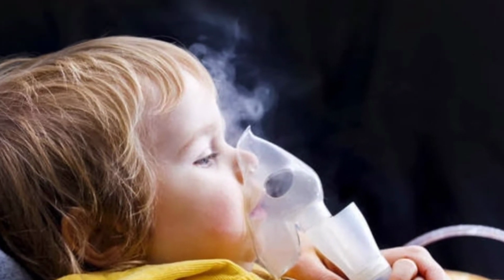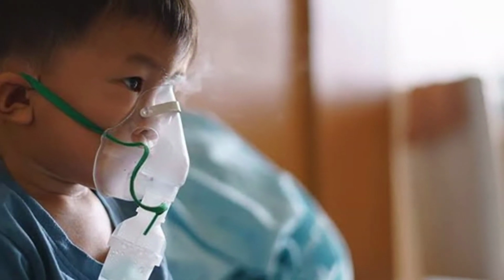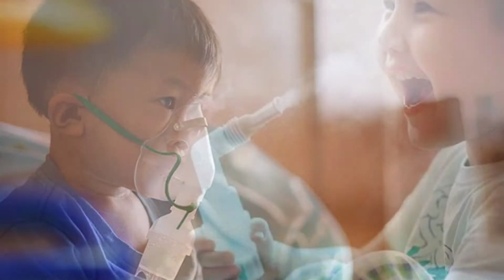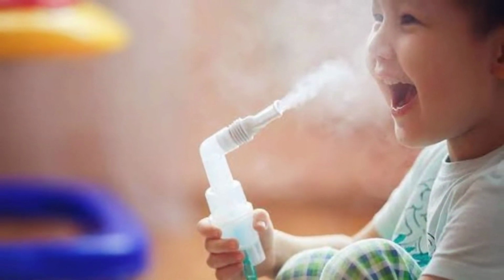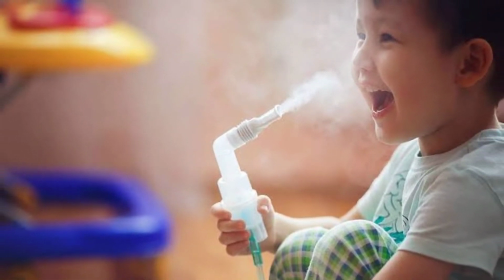Nebulization is a process of dispersing a liquid or medication into microscopic particles and delivering it into the lungs as the patient inhales through the nebulizer. It is also used to liquefy and remove retained secretions from the respiratory tract.